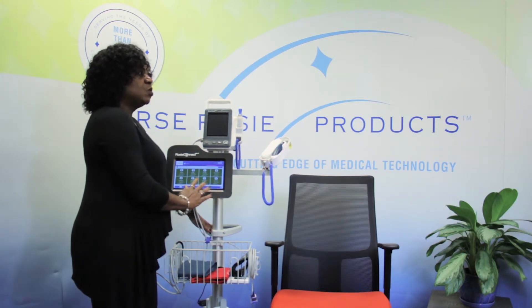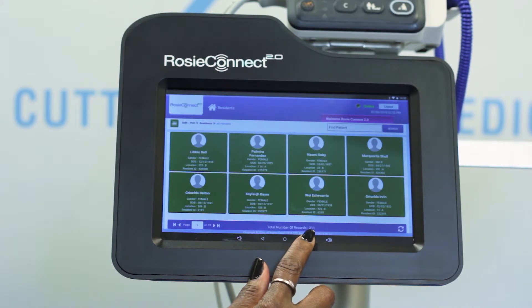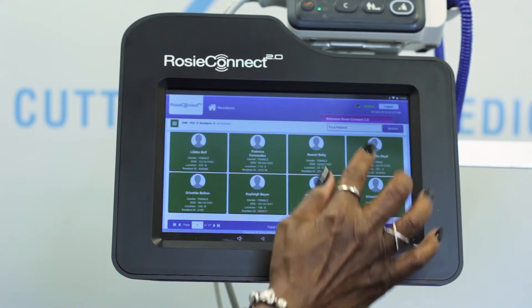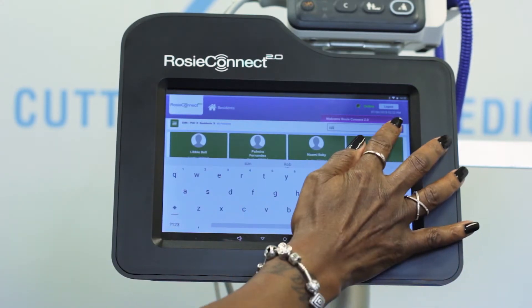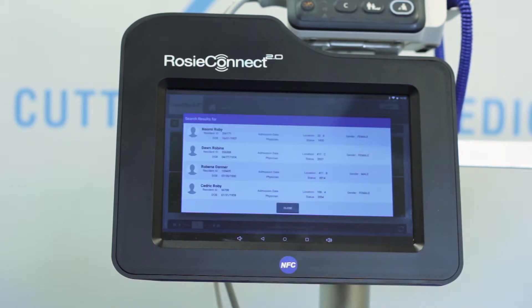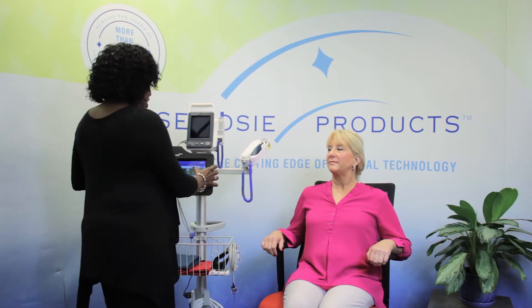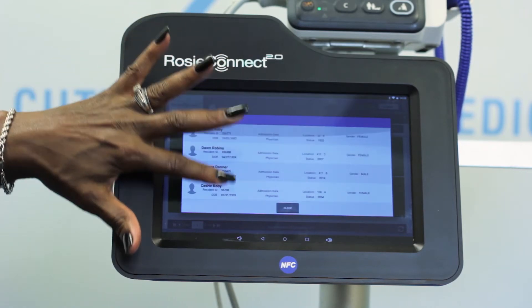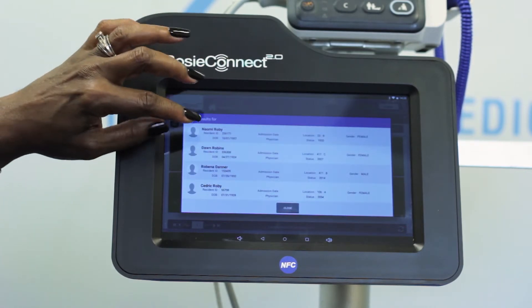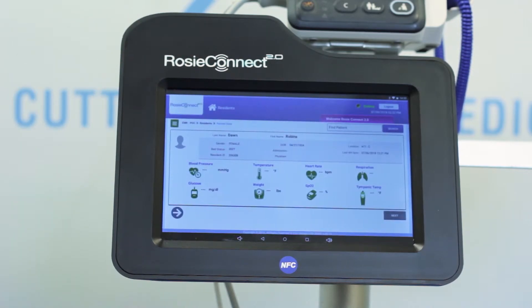Okay, now that you are logged in, the first thing you will see are your residents. They are in no certain order. At the bottom of the page you will see the total number of residents — this count is current in real time and reflects any discharges and admissions. If you do not see the resident you need to take vitals on, select Find a Patient. You will then put the first three letters of their first or last name and it will bring up the search results. I am here with my resident Dawn Robbins, so I enter R-O-B and select search. My search results come up and I can scroll to find her.